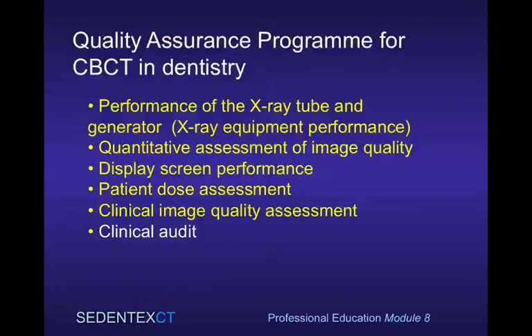Finally, let's look at clinical audit. In a sense, this is still part of clinical image quality assessment, but we choose to give it some prominence here because it is something very practical that the dentist with a dental cone beam CT scanner can do.